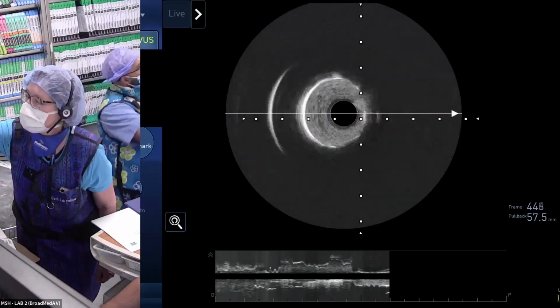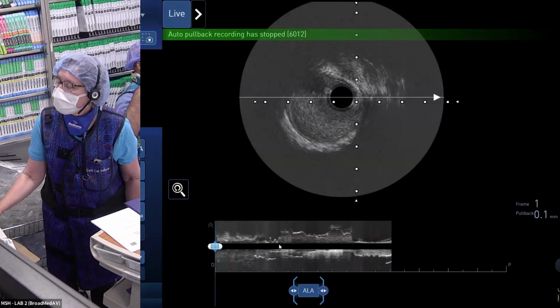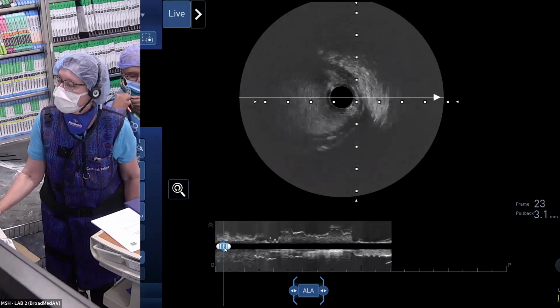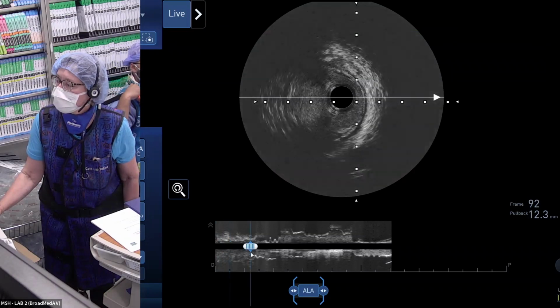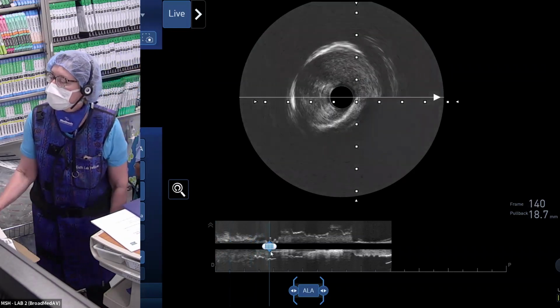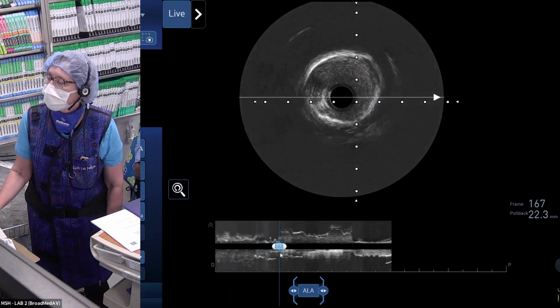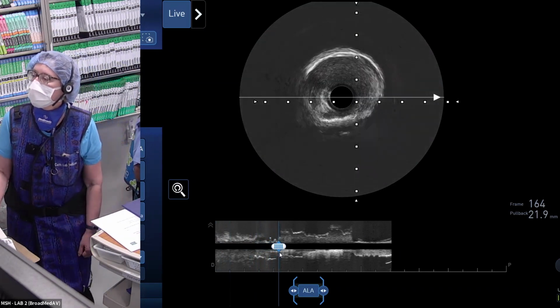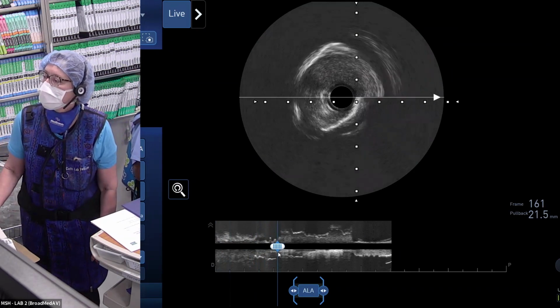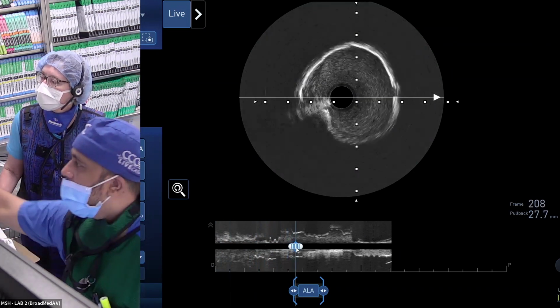Okay, what do you see now? So the LAD lesion, whether it's calcified or not, that is what we need to see, how much calcium it is. Second, FFR is 0.76 in the LAD. Knowing that the patient did have some ischemia in the apicolateral wall, maybe from the diagonal, I was not convinced how bad the LAD is, but the LAD had a positive FFR of 0.76 3 weeks ago. So it's physiologically significant and anatomically intermediate.